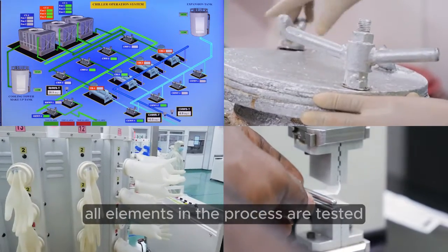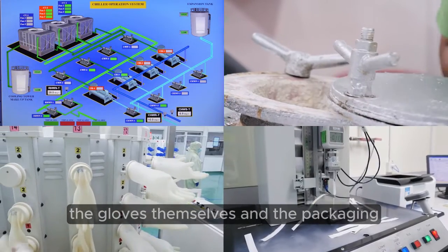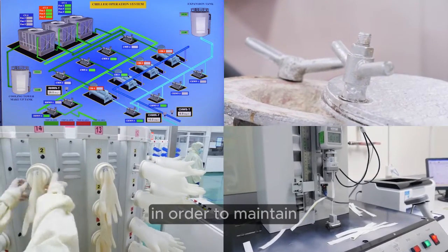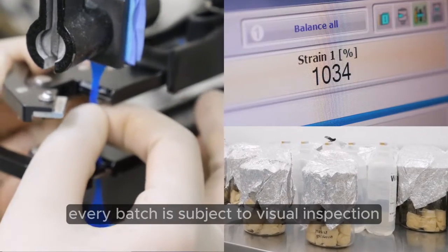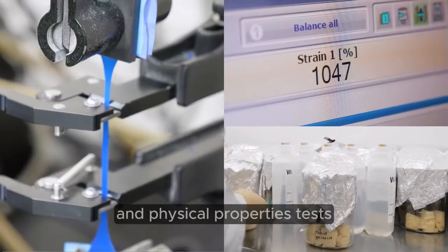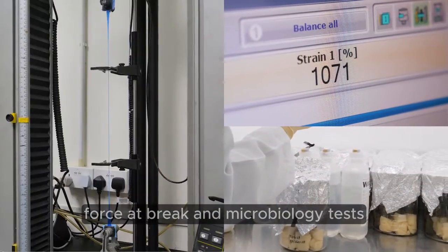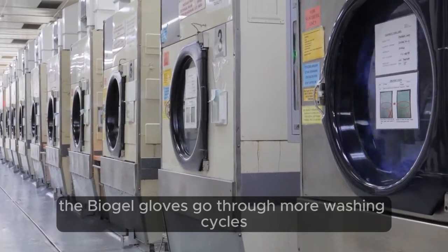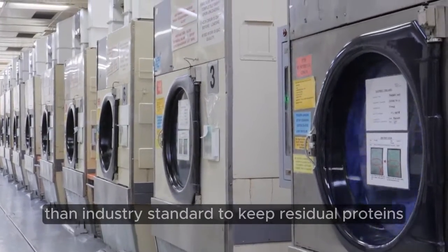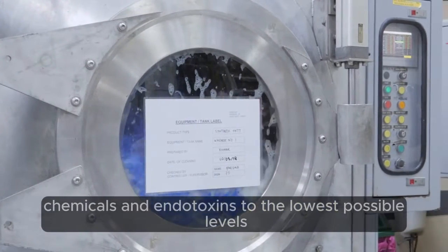All elements in the process are tested – the environment, the raw materials, the gloves themselves, and the packaging – in order to maintain and ensure the best possible quality. Every batch is subject to visual inspection and physical properties tests. Among these are tensile strength, force at break, and microbiology tests. The Biogel gloves go through more washing cycles than industry standard to keep residual proteins, chemicals, and endotoxins to the lowest possible levels.